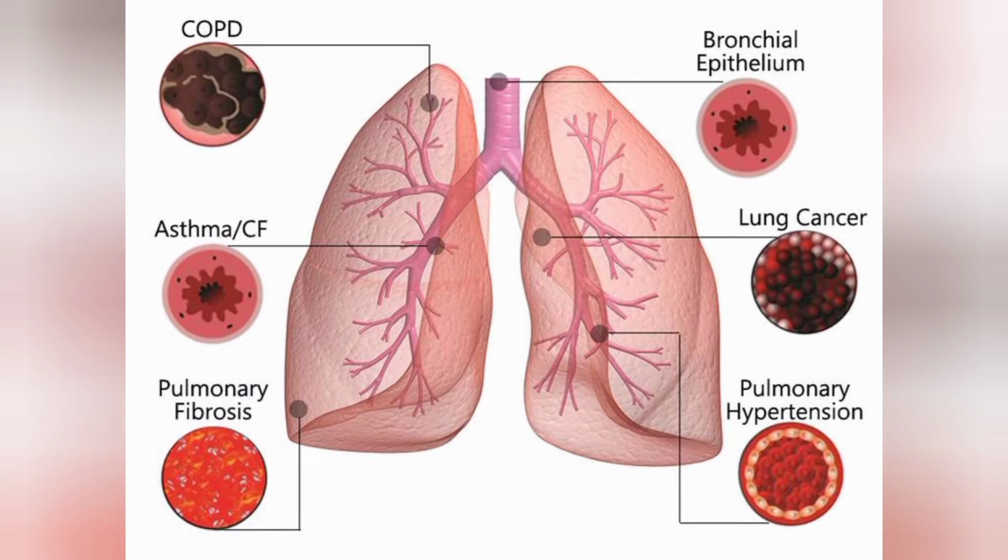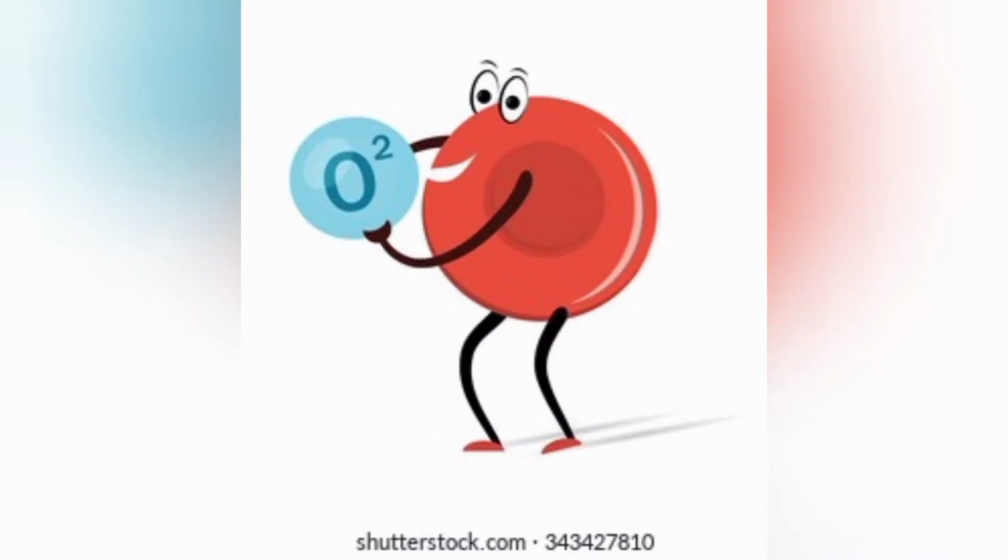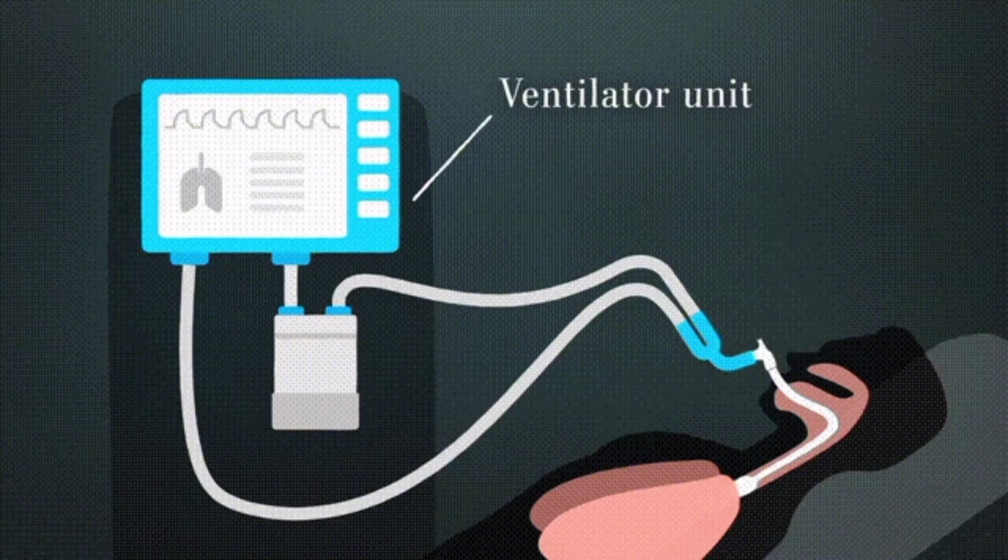In such cases, the patient's body would not get enough oxygen, which would lead to death, because oxygen is the most important factor our body needs to run all metabolisms. In such cases, ventilation is used for the patient who cannot breathe themselves. So, a ventilator is nothing but a supportive system in cases of breathing system failure.